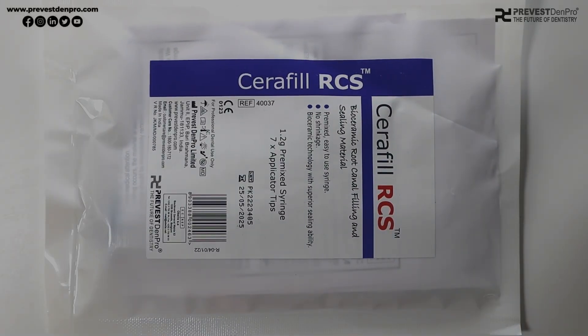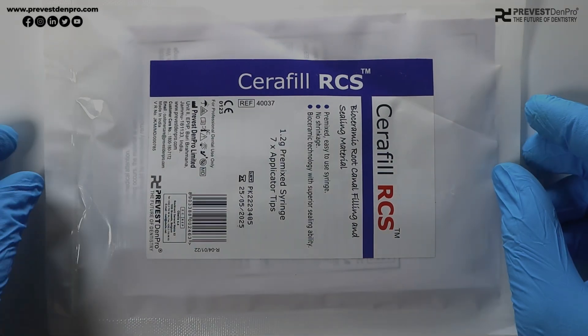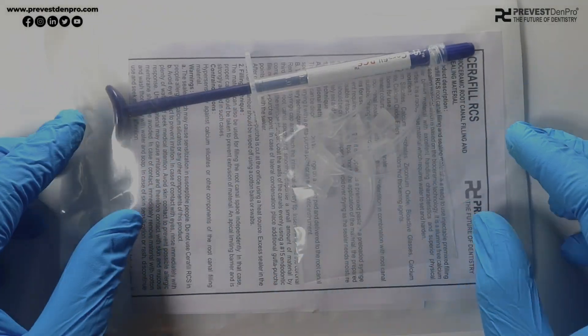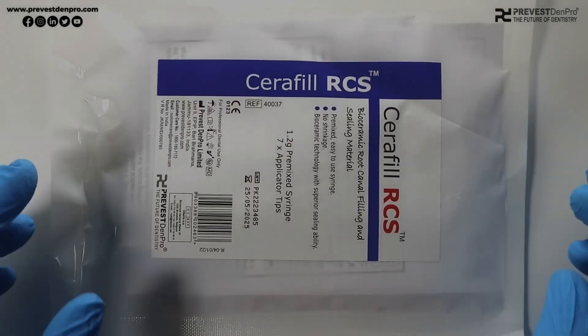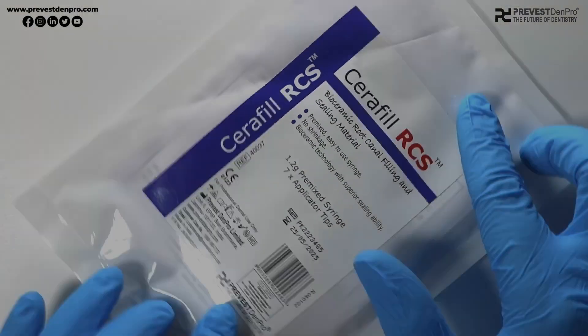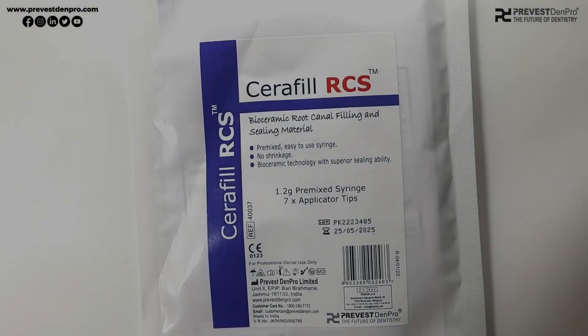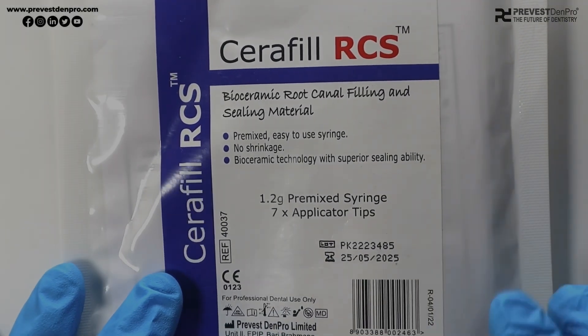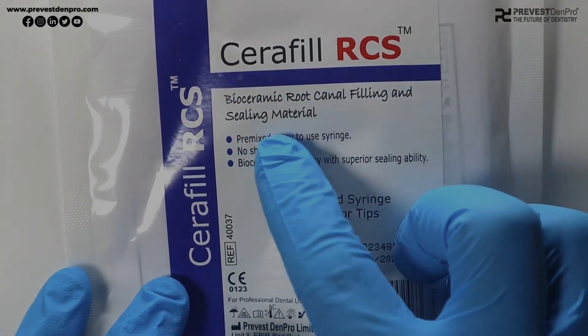Today's video is about Cerafill RCS. We are going to discuss what is Cerafill RCS, why and where we need to use this product, what is its composition, and what are the different methods to use this product. So let's begin. Cerafill RCS is a bioceramic root canal filling and sealing material.